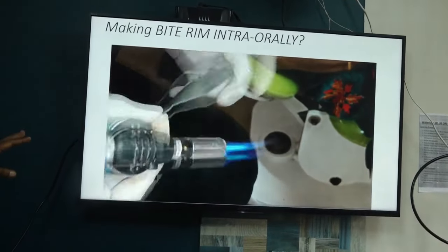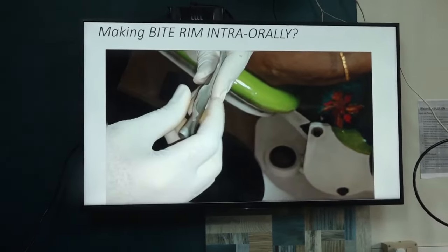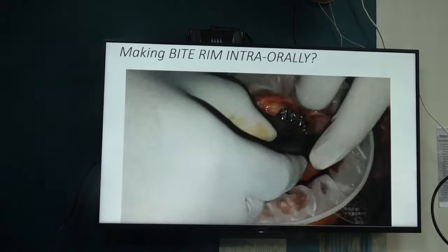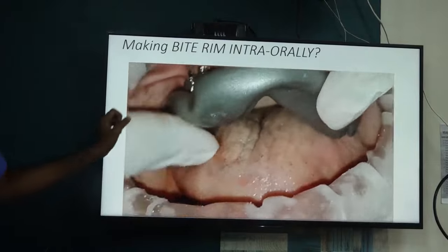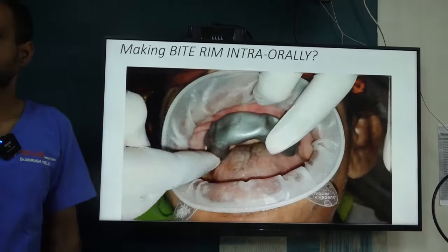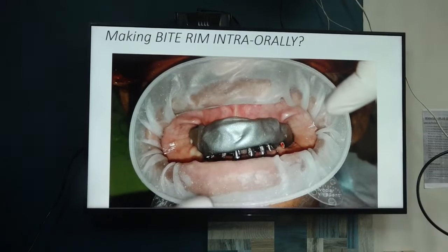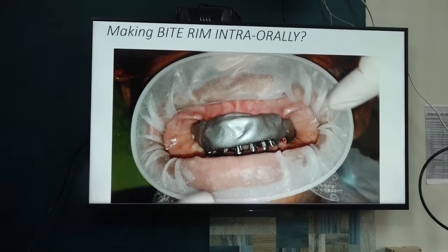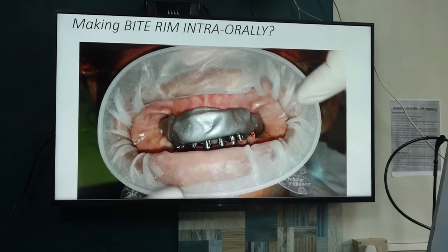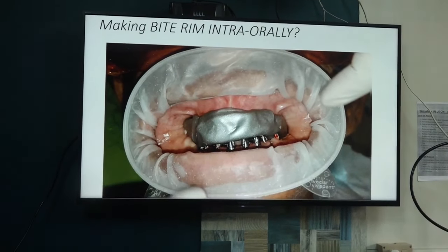So this is also a real time video, it won't take more than 1 minute. Start from the beginning. Look closely. See, first she is pressing. Then she is pressing with the fingers, buccopalatally you have to. So this will make the wax tightly adapt with the implants. If you don't do this step, it will be very loose. You have to press it from all directions towards the abutment so that it tightly attaches.